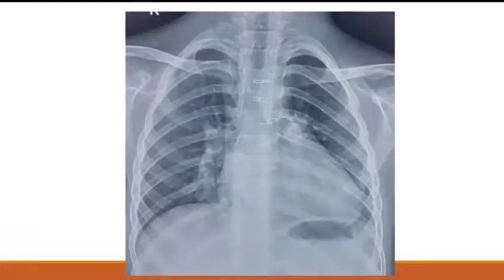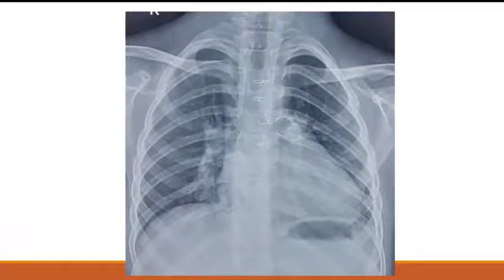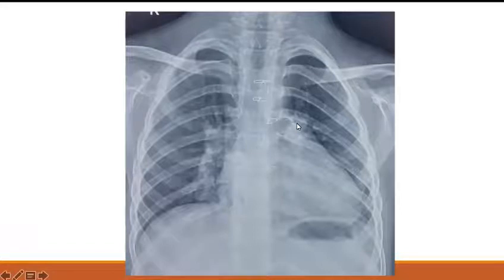This is an 8-year-old child who is post-operated — you can see the sternal wires. This is a post-operative chest X-ray PA view, situs solitus, levocardia, CT ratio around 0.6, no right atrial enlargement. There is prominence of the pulmonary artery — it appears dilated. Apart from that, there is a calcified structure which can be seen here, most likely in the RVOT and pulmonary artery region.